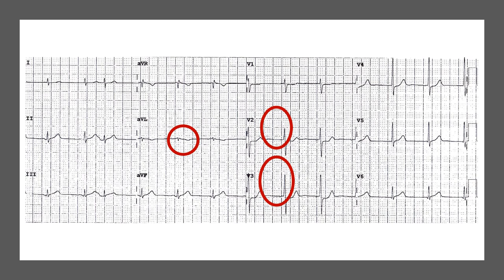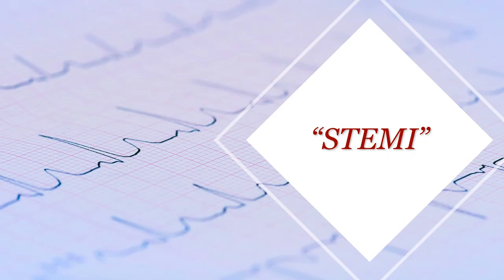We've got T wave inversion in AVL and we've got ST depression in leads V2 and V3. In the presence of chest pain, that should concern you about ongoing ischemia. I'm going to leave this case at this stage and start talking about the important topic of STEMI.